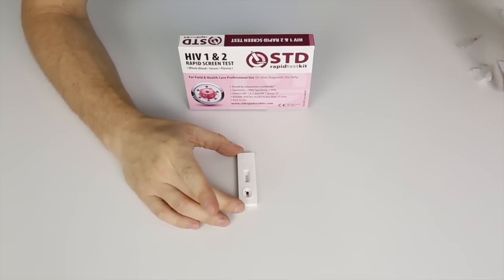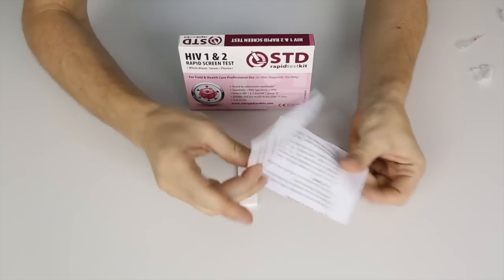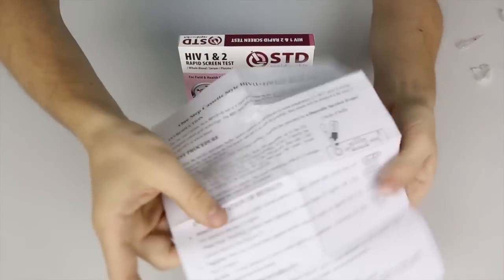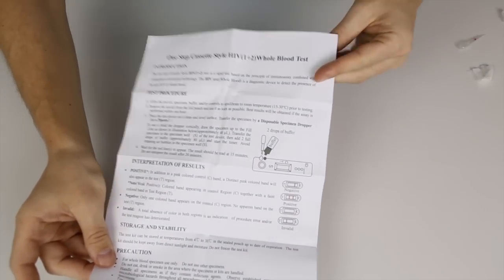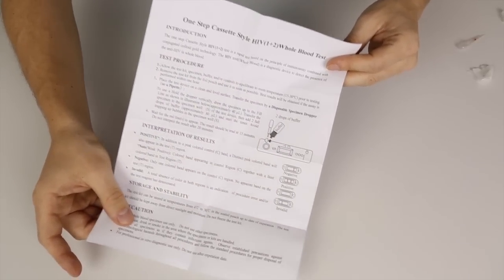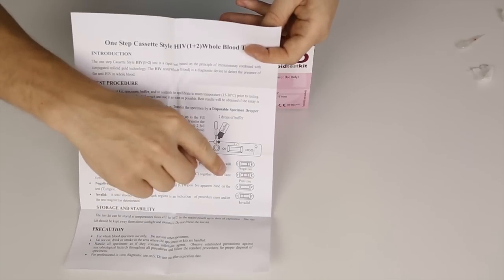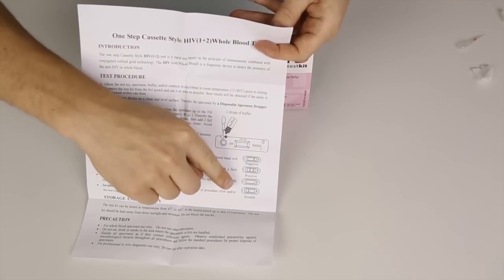Inside the package you'll find the instructional sheet. It shows you the content of the kit and a little bit of instruction. On the back of it you'll also find step-by-step instructions, and if you look at the bottom right corner, you will see the results and what the different results mean. You can interpret the results on the basis of this.